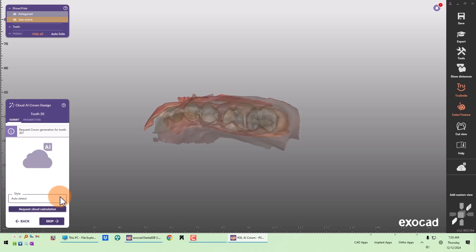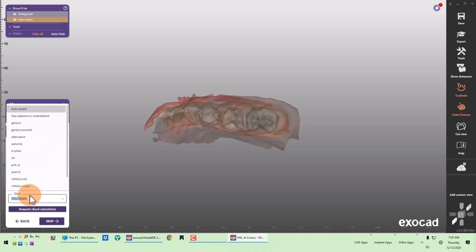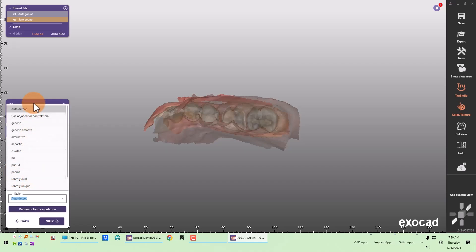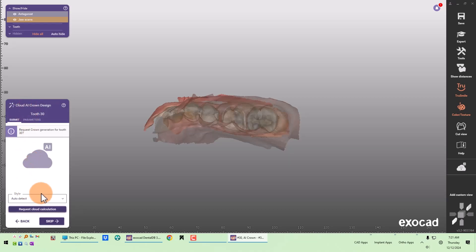You can use the ExoCAD version of a biogeneric generation, which is the auto detect style, or you can choose one of your tooth libraries or one of the ZRS libraries. I just have it defaulted to auto detect.